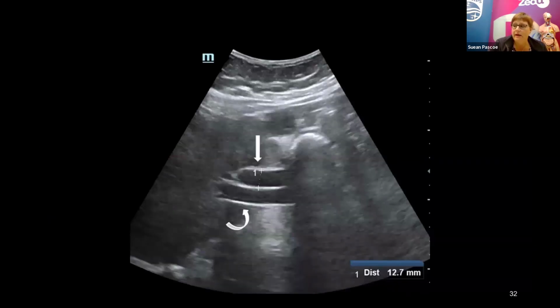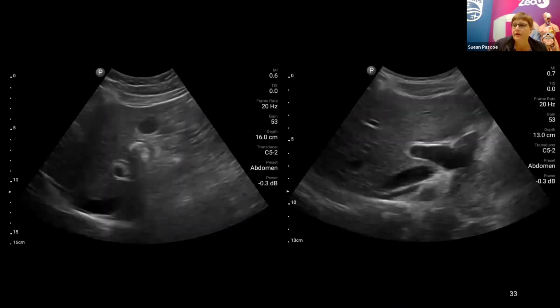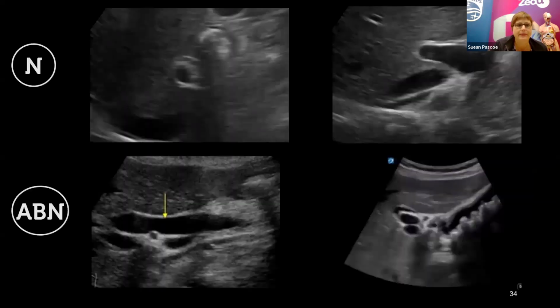So you can see when it's abnormal, it's really dilated, and you get like this double barrel shotgun almost. It's dilated, much, much easier to see. So here we've got a couple of normal ones. Here we've got this tiny bit here. It's probably a little bit intrahepatic, but it's really tricky to find where that hepatic artery was. This one you can see a little bit more, completely thin. I didn't even put the calipers on because the calipers would have just obscured where you could see it. You know that it's really, really thin though.